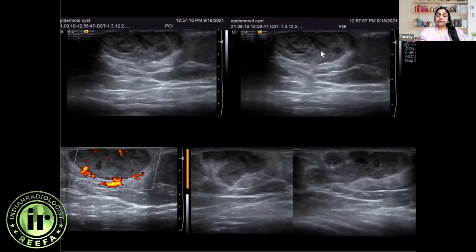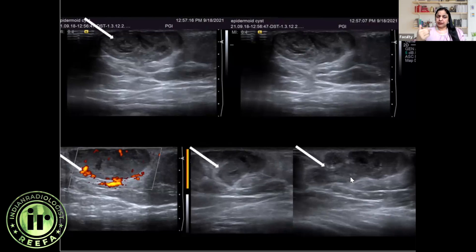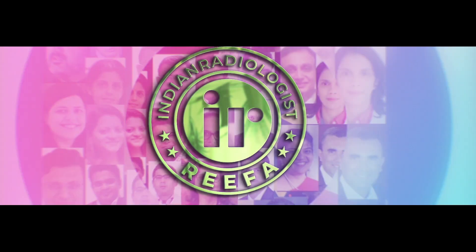Breast epidermoid cysts are BIRADS 2 category lesions and we do not need to put a needle into them — which had been done prior to the patient presenting to our hospital, leading to inflammation of the surrounding breast. We can see a contained collection due to post-FNAC changes and vascularity around the lesion due to infection. Radiologists should learn to identify these epidermoid cysts, which are taken en bloc by the surgeon and are no-touch lesions for radiologists, characterized by their classical lamellated appearance and skin-based location.